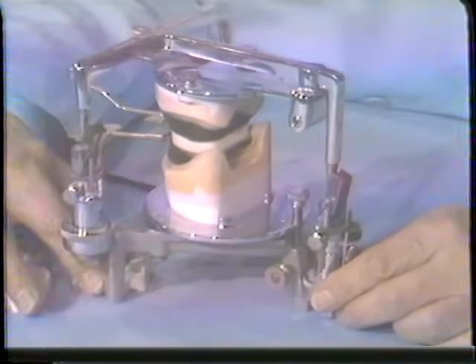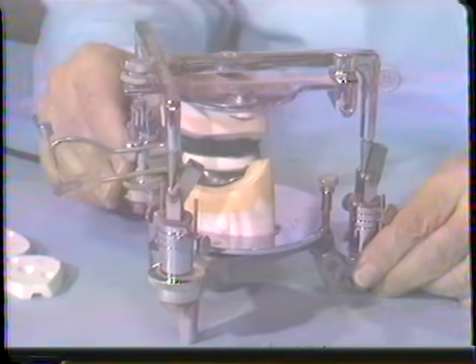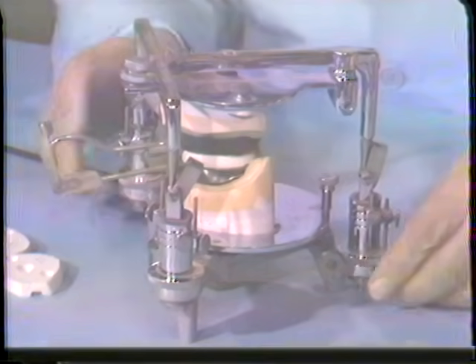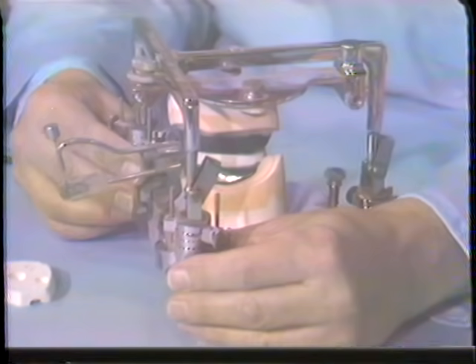They're marked down, of course, on the card. It's all calibrated, so every time you set a tooth or you grind on a tooth later on, you have to move all these turrets around to the particular recorded position in order to check out your occlusion. Now, this gives us more information. It's a good instrument, but it is very time-consuming to use because of this fact of changing these turrets to these individual positions recorded on the patient.